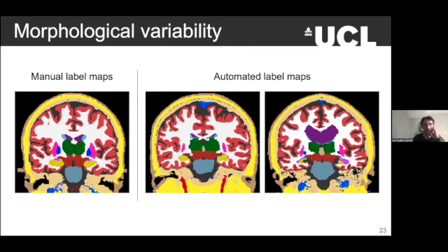And the beauty of this is that if you look at this or this, they're not perfect, right? They have little noisy speckles and segmentation mistakes and so forth. But the beauty of it is that we don't care, because remember, if you were doing supervised, this would be really bad, right? If your segmentation is wrong, you're throwing garbage in during training, and therefore you're going to get garbage out at test time. But here, because the images are synthesized from these segmentations, they are perfectly aligned by construction. So you get away with quite a lot. So it helps massively to add all these external cases from other data sets.